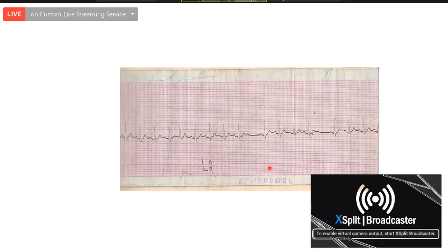What has this P wave done? Block the AV conduction. That's not block the AV conduction. They are blocked atrial ectopics. This is a blocked atrial ectopic. What do you mean by that?